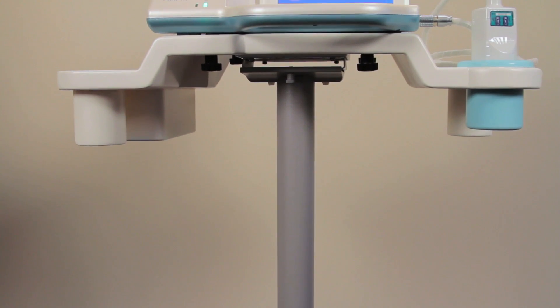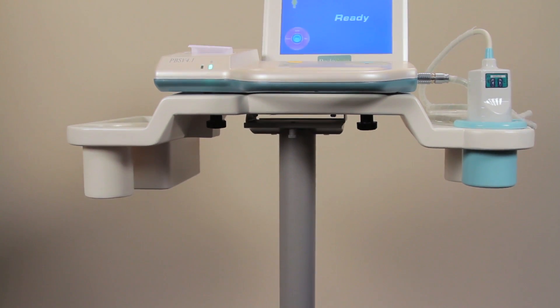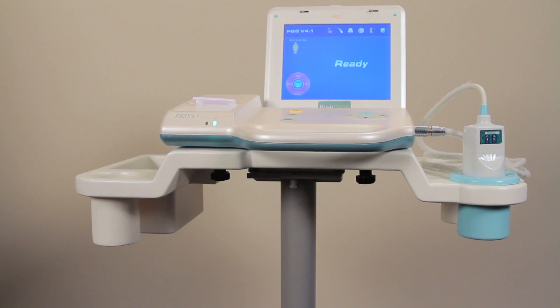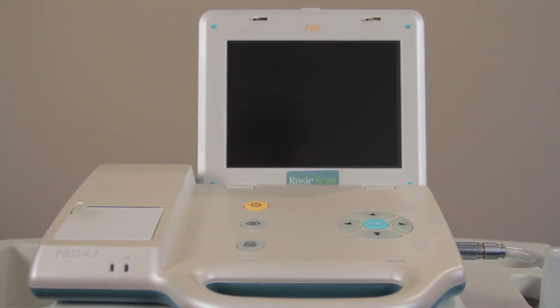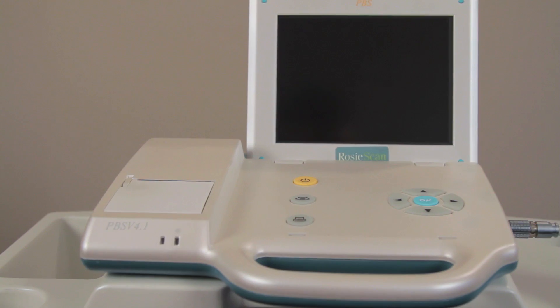Nurse Rosy Products is proud to introduce RosyScan, our affordable, accurate bladder scanner. RosyScan is an easy-to-use mobile touchscreen unit that is non-invasive and quickly delivers accurate calculations of the bladder volume of your patients.